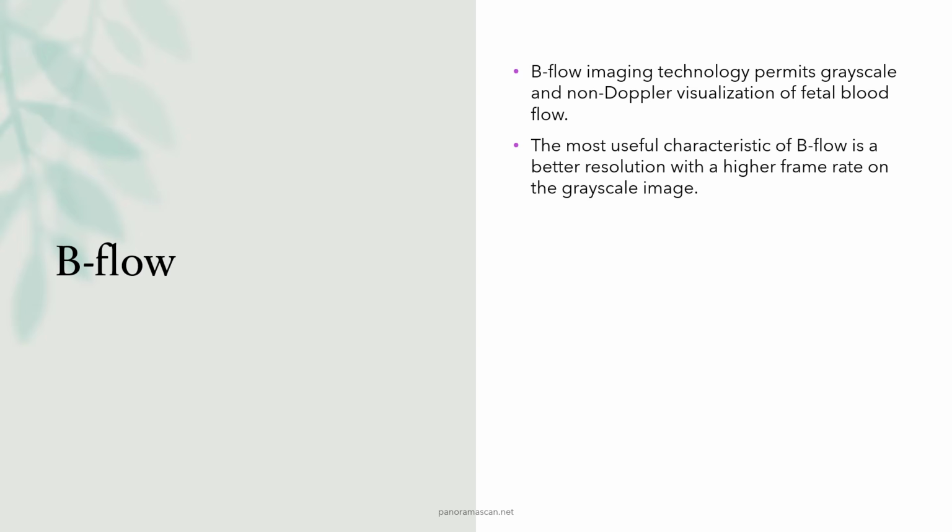B-flow provides improved resolution with higher frame rates, resulting in clearer images and better visualization of blood flow compared to traditional methods.